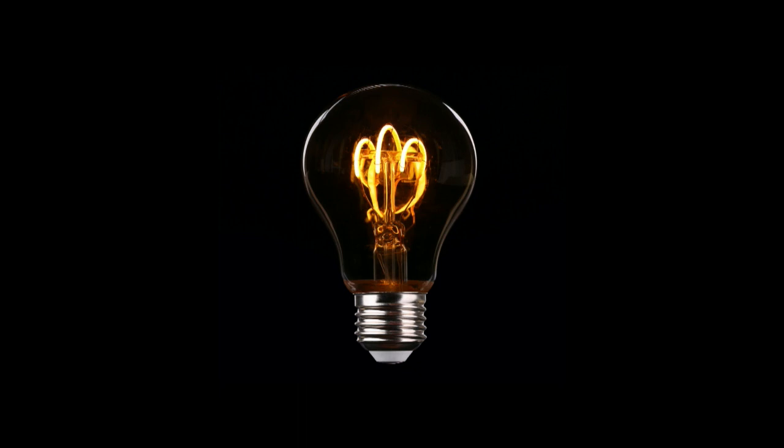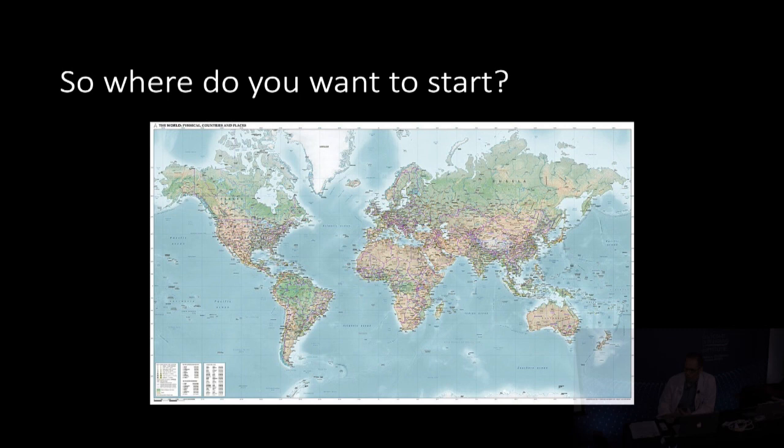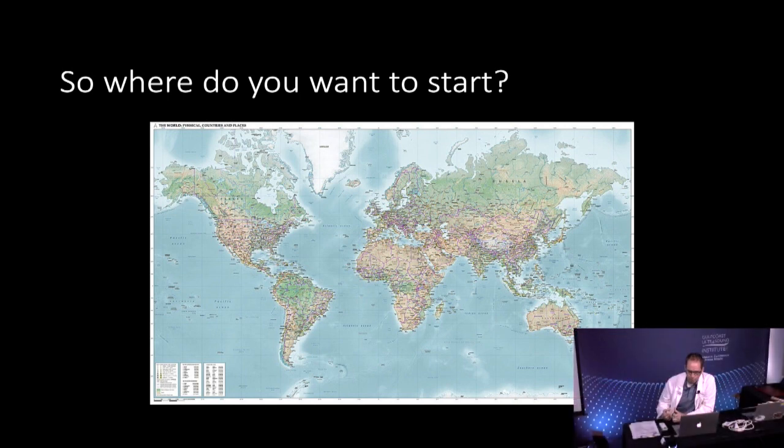We need to go and ultrasound the patient. So we grab the ultrasound and we go in there, and where do you want to start? The way that I approach critical patients is I like to start with the heart, the RUSH exam, the rapid ultrasound for shock and hypotension: heart, IVC, Morrison's pouch, aorta, and pulmonary. That's kind of the order that they take things in, but based on your clinical suspicion, you can start anywhere.